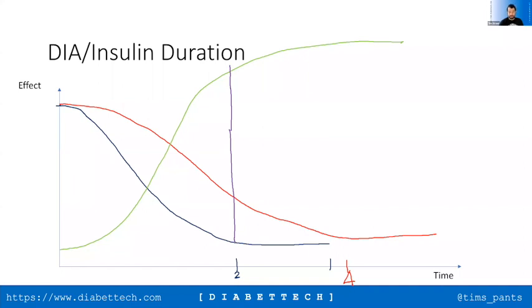So what does the loop or the AAPS algorithm do when it doesn't have insulin on board and it can see glucose levels still climbing? Well, it gives more insulin again, which means that you start to stack insulin in this period of time here if you've got it set at a very low level, which is why we set our DIA at a higher level, because all the clinical studies show that the duration of insulin action in everybody, including children, is at least 5 hours. And if you have it set to too low a level, what will happen is the algorithm will start to deliver more insulin and you will end up with hypos towards the end of your DIA period that you weren't expecting to happen.